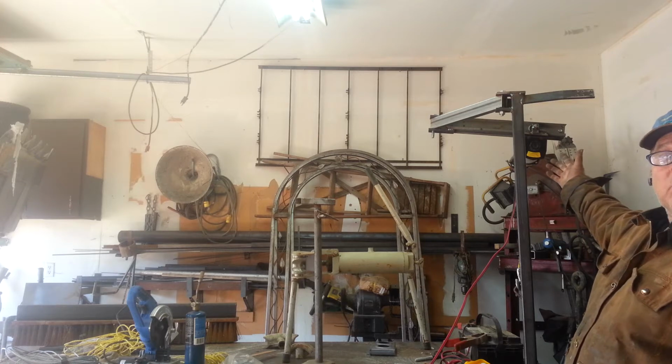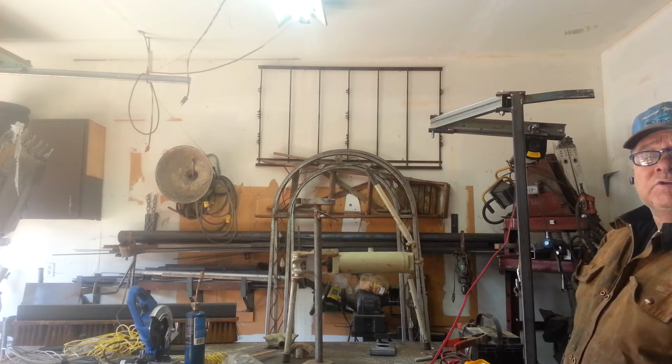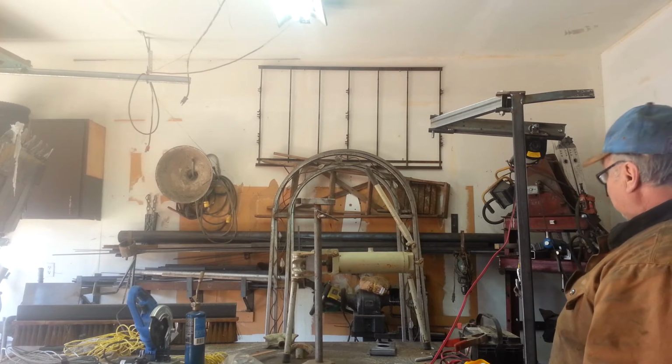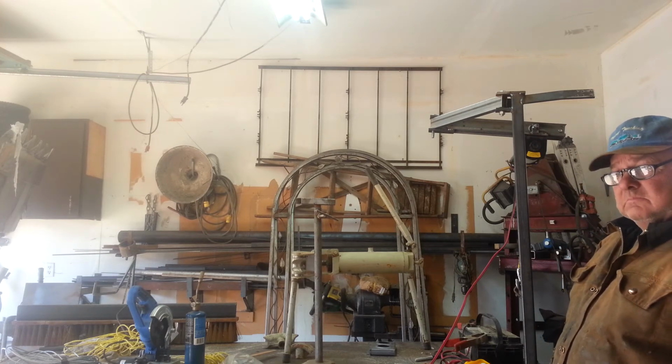The biggest cost was the winch. It was $69 on sale at Costco. The rest of it was steel I had laying around. Lots of labor figuring it out, but it's well worth it.